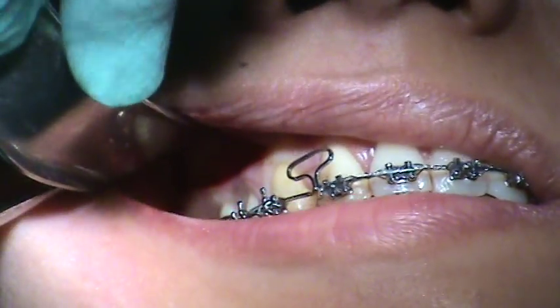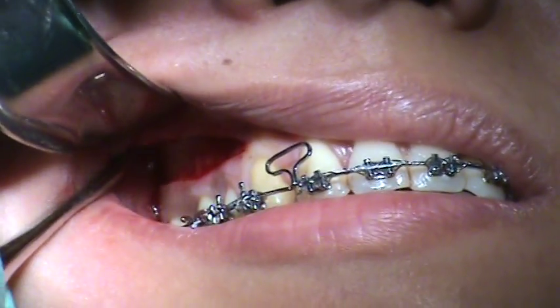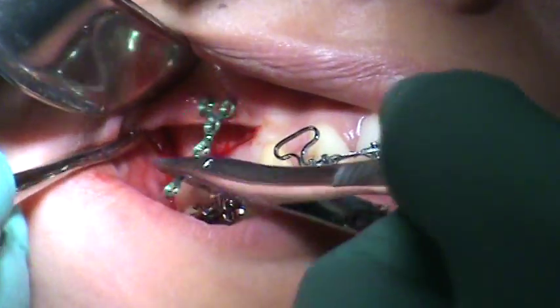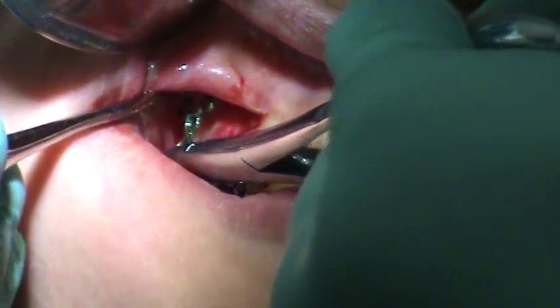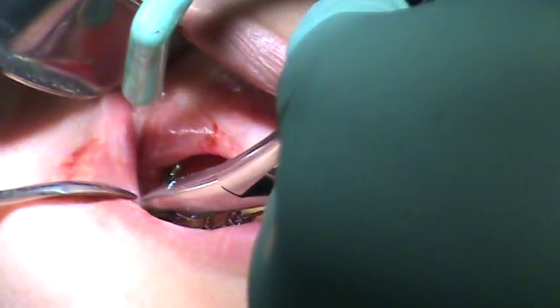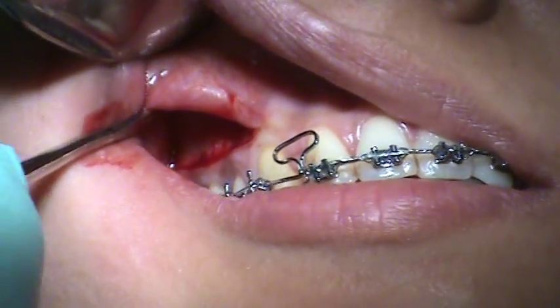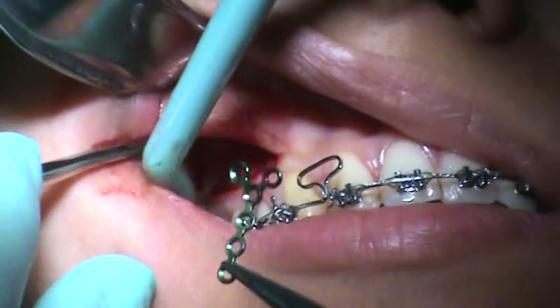That was checking for two things: line of force and bone quality. The plate is being adapted to the bone for better placement.